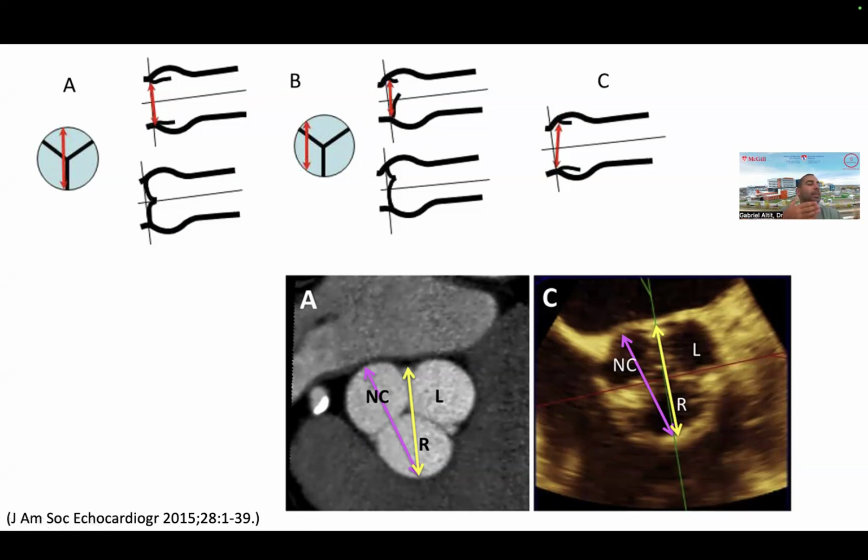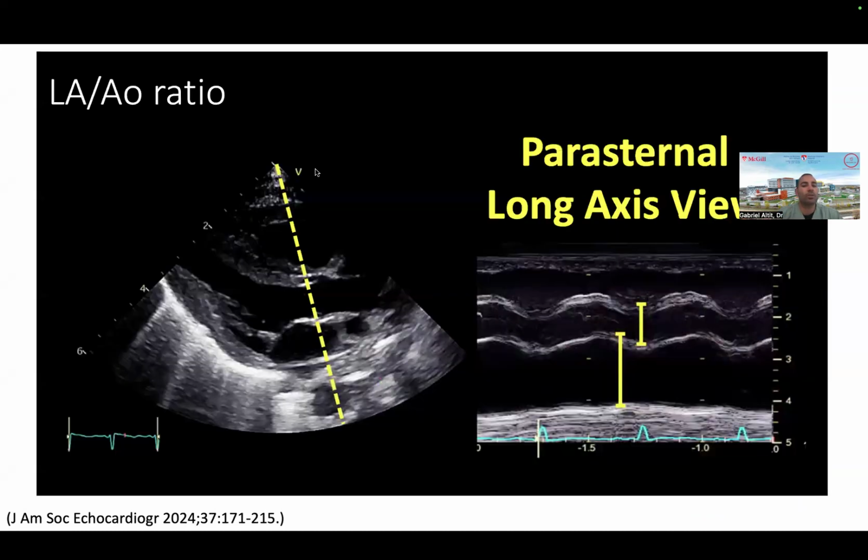So what's important is keeping consistency among people doing this measurement. Typically, the way you do it, you should always do the same, if you're going to be taking care of the patient based on only this marker, which you should never. Basically, you should use a combination of markers to decide what to do with your patient.